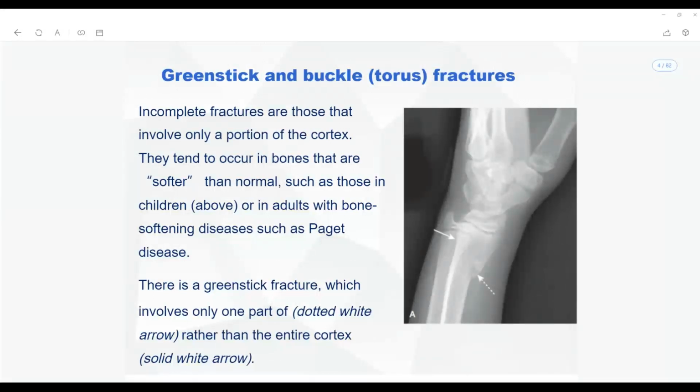Or let us say when I'm taking the x-ray of the femur, I'm going to include either my knee joint or my hip joint. Generally they include the proximal joint. For example, when looking at the humerus, they will include the glenohumeral joint, the shoulder joint. For the radius and ulna, they look at the elbow joint.